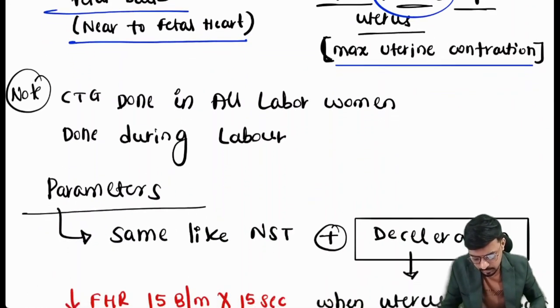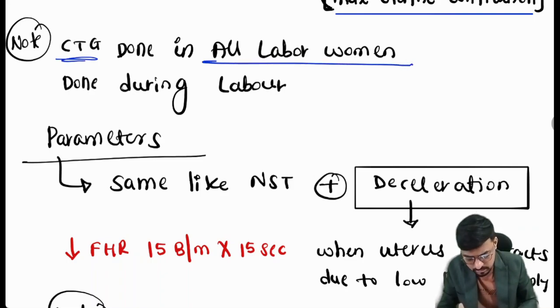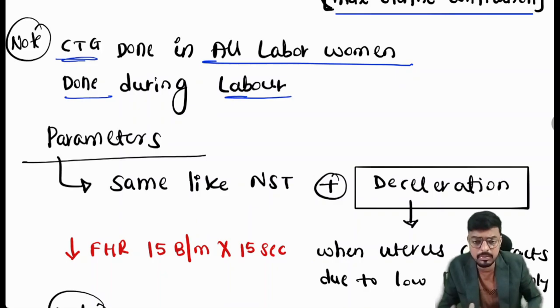The next one: I told you the NST is done in high risk pregnancy, but the CTG is done in all labor cases. So it is done during labor. It will not be done during the antenatal period.